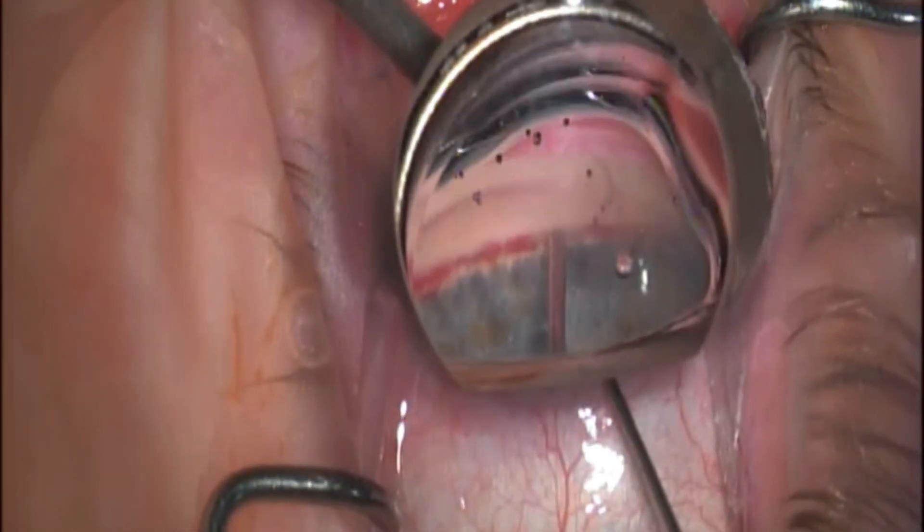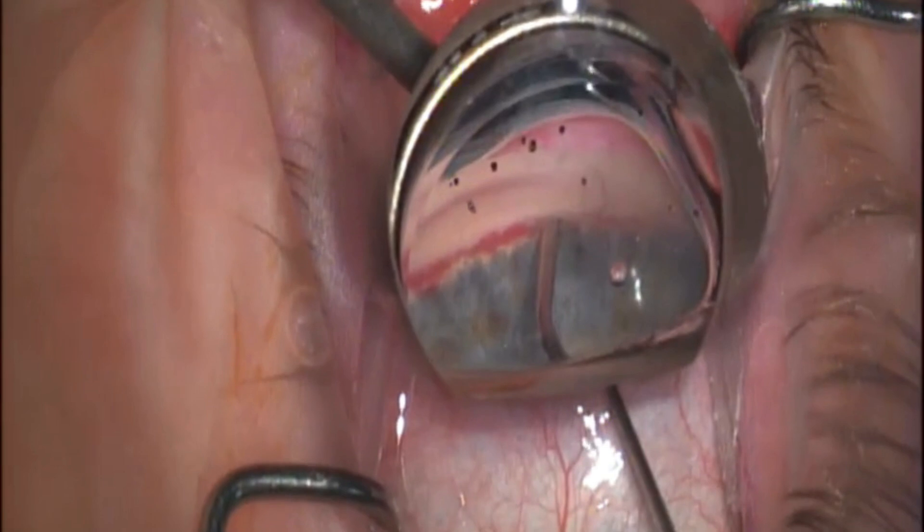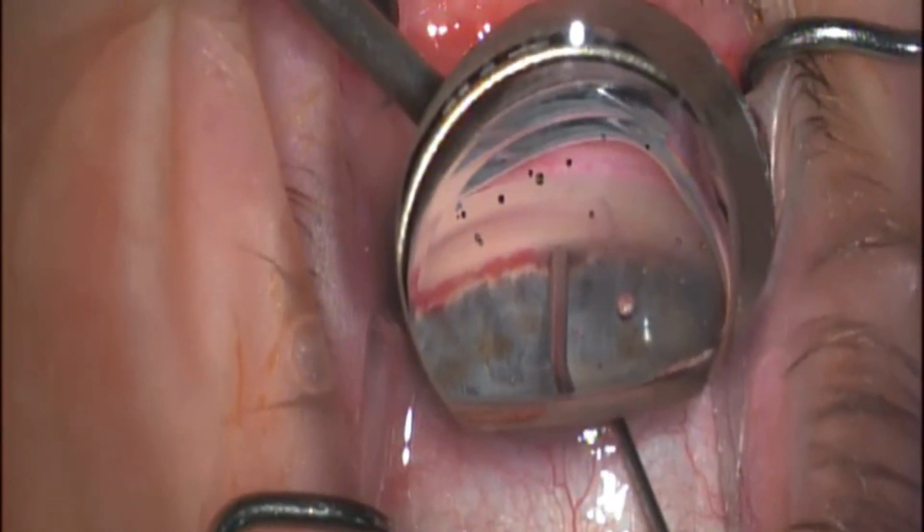You're going to see me touch the spur and then pop right down off of it. When you pop off of the spur — like you're going to see right there — it immediately puts me in the exact placement I want to be at.